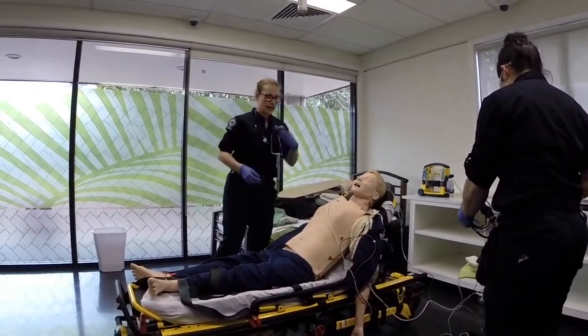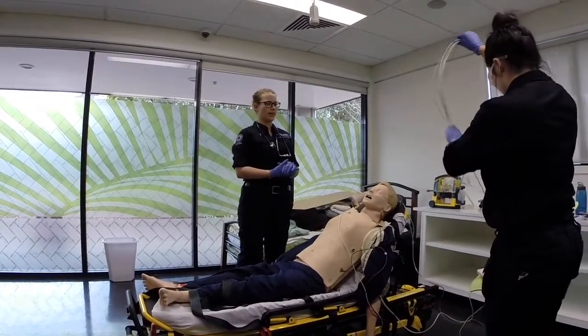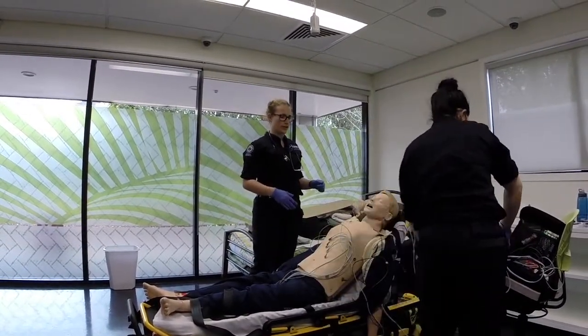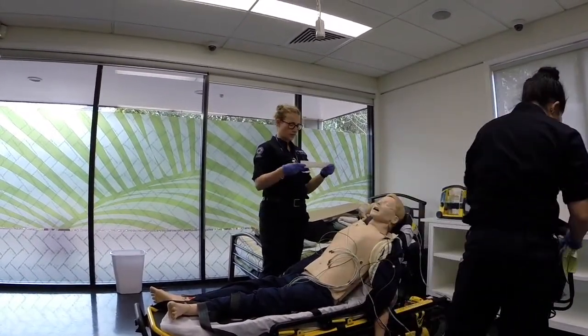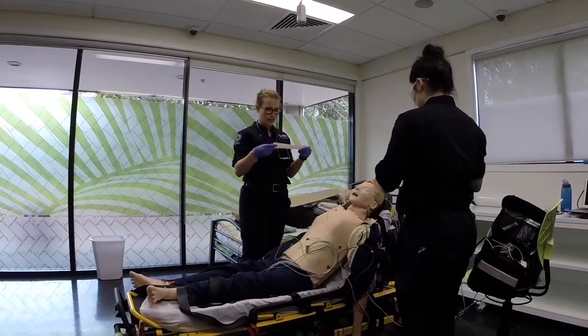Oh, okay. And what I want to do is we'll get a 12 lead going, and if you can also get the pads on. Yeah. Cool. I've got a 12 lead attached. I'll just punch it out for you. Perfect. I'm feeling a bit dizzy as well. Oh, real dizzy, okay? Cool. Sweet. So it's definitely confirming VT, and the best leads are in V2.